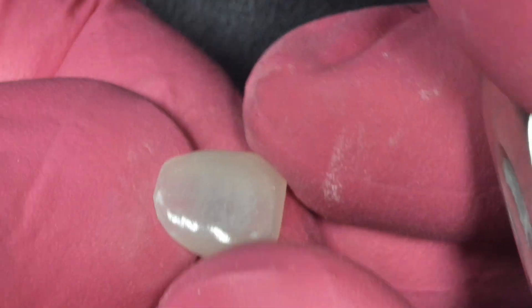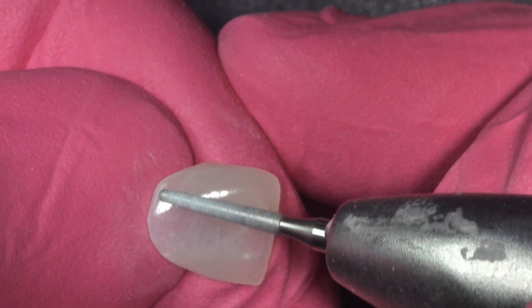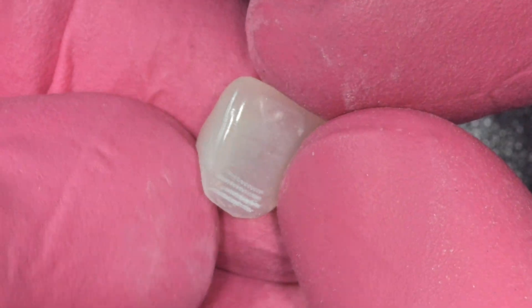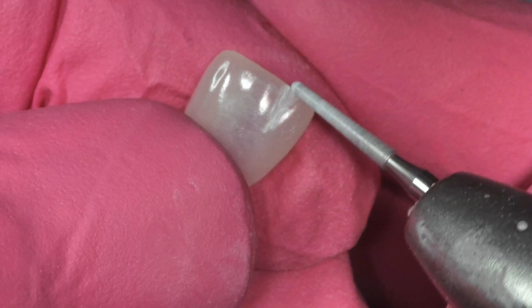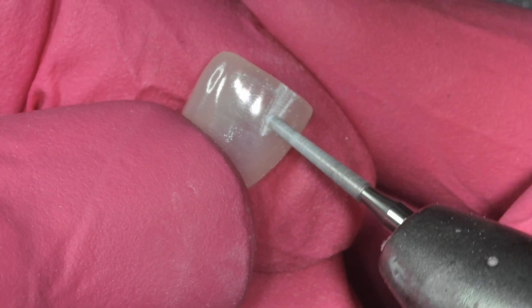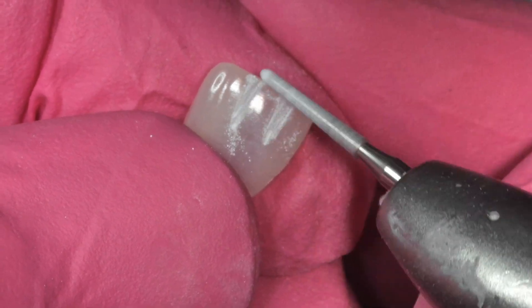Sometimes when you print an anterior crown you want to add some micro textures such as imbrication lines, facial depression accentuation, and even pockmarks. Typically in the past when you tried to do this with a printed resin, not only is it super easy to cut like butter, but it also just polishes away. Whereas this material cuts a lot more like glass, and that's probably due to the incredible amount of porcelain that's in here.